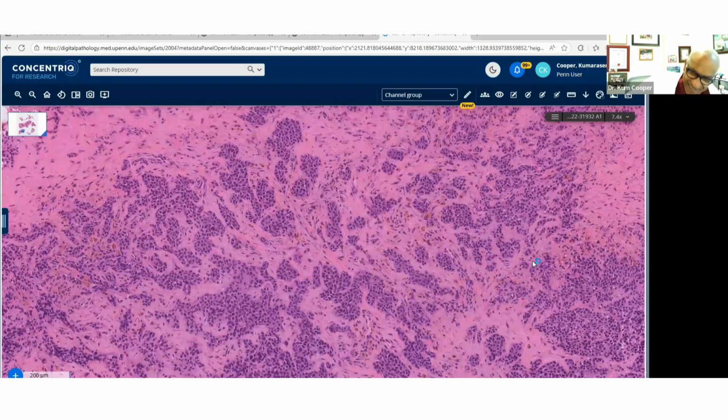And so a week or two later, this came back with EWSR1, and you all know the partner to clear cell sarcoma, because I've given you the diagnosis, which is CREB1. And so they asked me for what you call a blessing. And lo and behold, the marker panel was full house. The immuno was full house. And the FISH, no, this wasn't FISH. This was sequencing because they got both fusion partners.